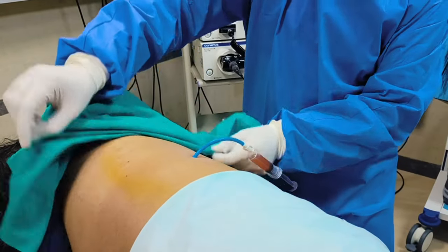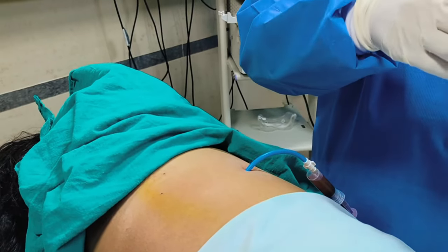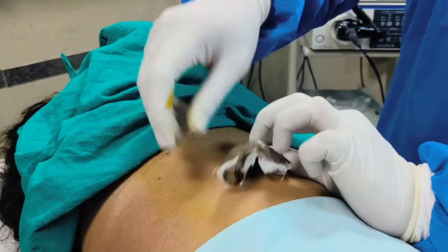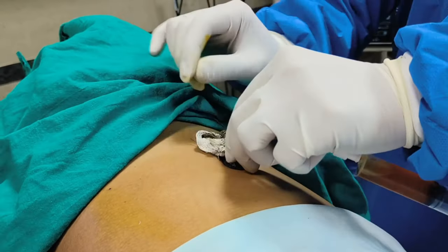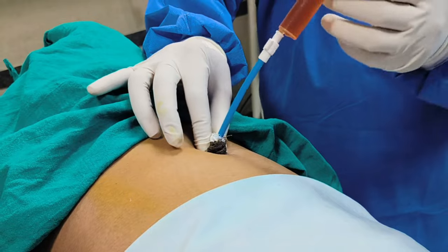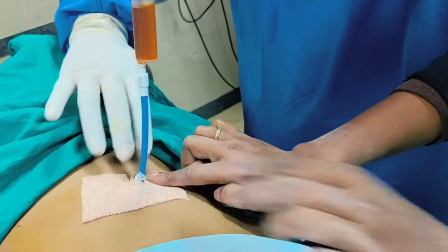For dressing we will take one gauze piece soaked with a little betadine. We will wrap it around the pigtail catheter. There is no need for extensive dressing — only a little dressing is sufficient. There is also no need to give a suture, because the surgical site is just 3 to 5 mm and the tip has coiled inside so it will not come out. There is no need for suturing the wound. Now we will use dynoplast to fix the catheter.